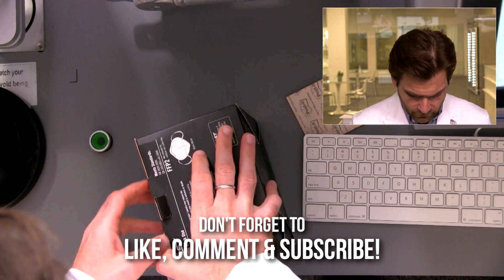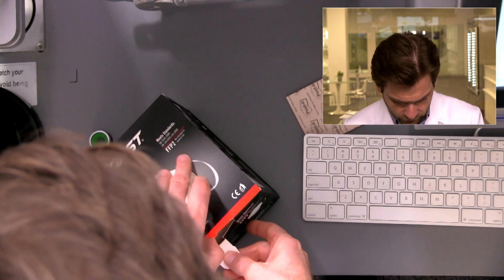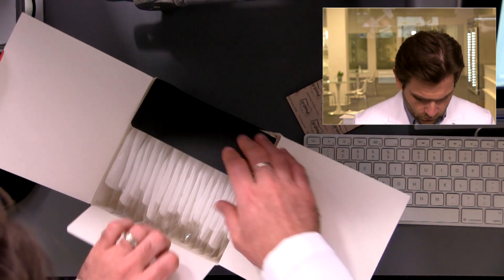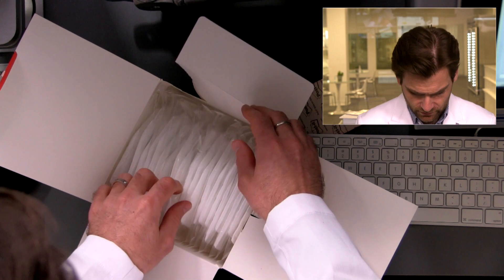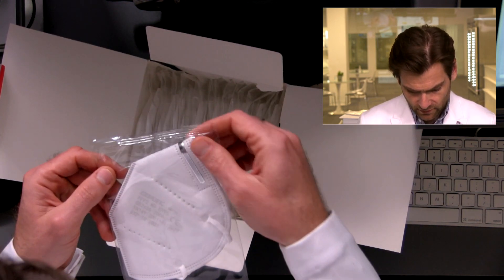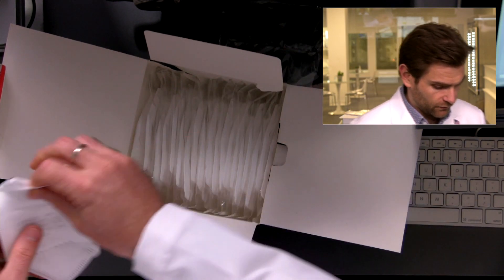All right, let's open it up. Normally they open from the top, but this one — I like the design of the box, we'll get to that in a second. Ooh, look at that, that's really nice. Individually sealed. I like it. This one might be legit — I'll tell you why in a second.